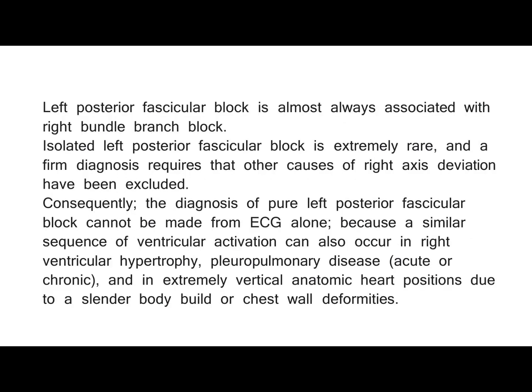Left posterior fascicular block is almost always associated with right bundle branch block.